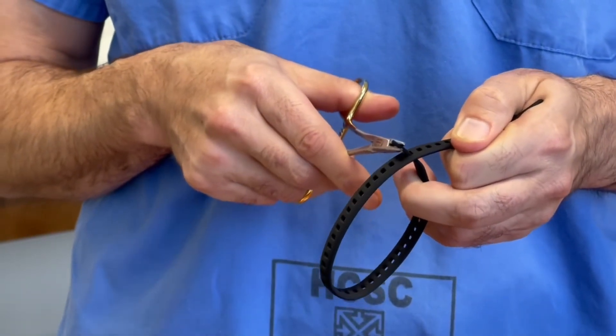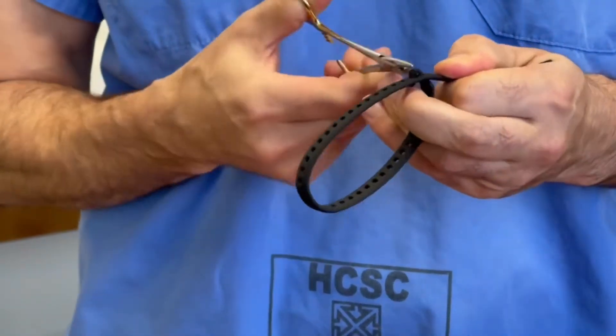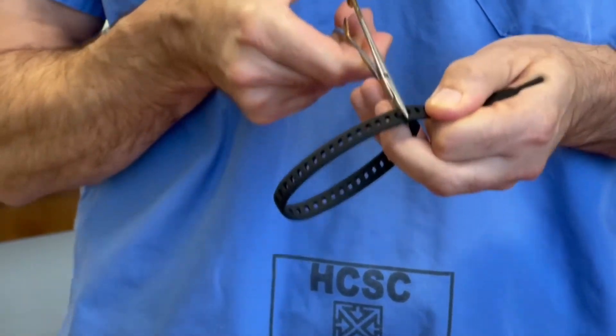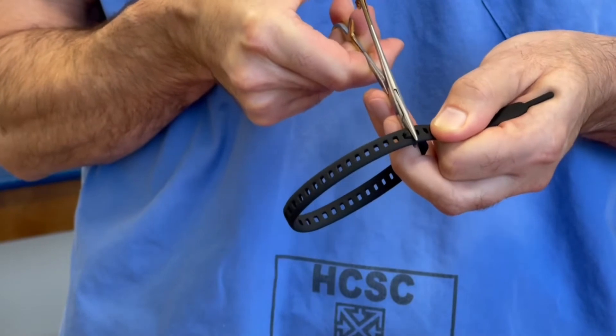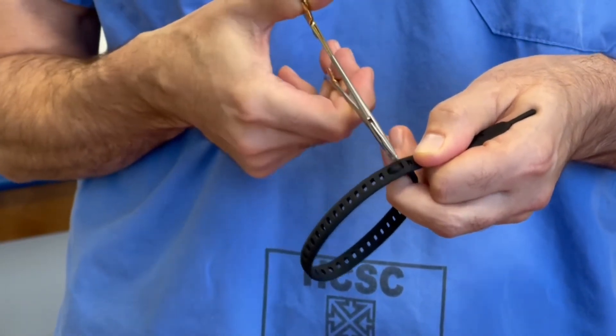We think this first tab is best done with a loop configuration where you drop it into the adjacent perforation and then smooth it out. I like to use this needle driver.